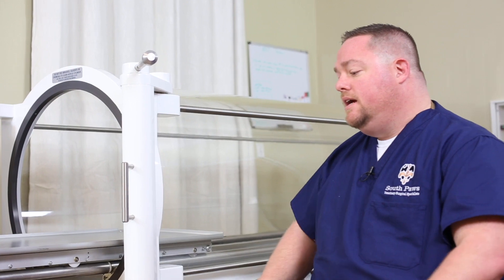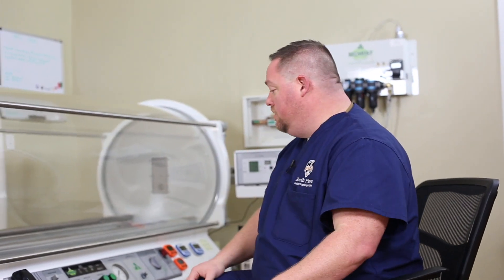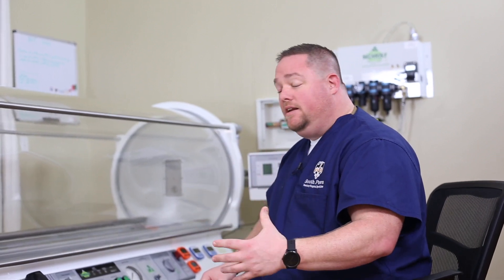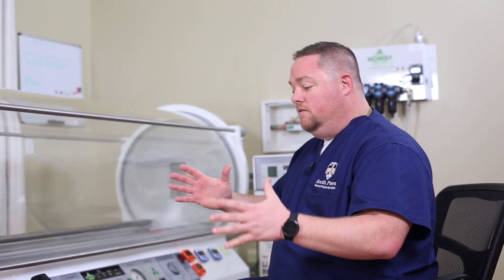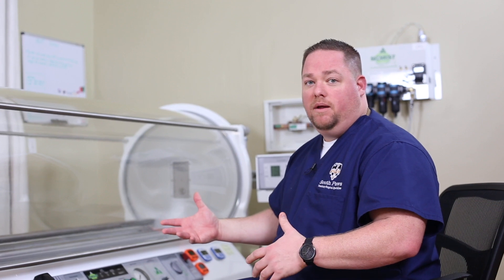You also get this really nice scissor lift to help the patients get in. This is a phenomenal chamber — it's been a great upgrade for us. We can treat multiple patients. We can put really large dogs like a Newfoundland or a Great Dane in here with no problem. In terms of the smaller dogs, we can fit up to four small dogs at a time to treat. So it's really enhanced the efficiency of what we're able to do here.